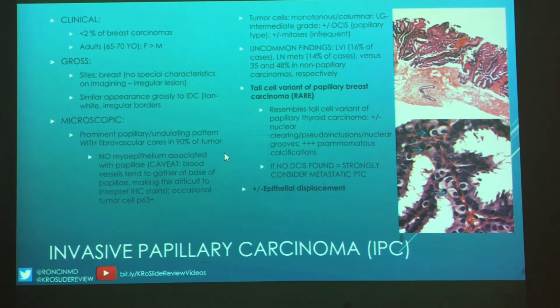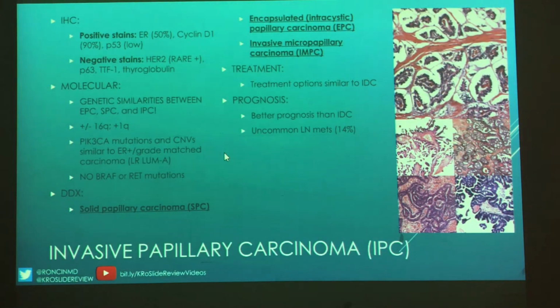TTF-1, I would say. That's a good one. What's another one that's thyroid? It's one that I always forget to think about. So you could do thyroglobulin. Yes, I always forget about it myself, and then someone mentions it and I'm like, oh yeah, that one. Both of those will be negative, so that'll help you.